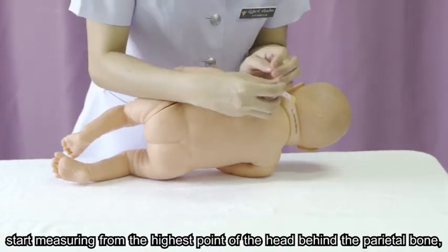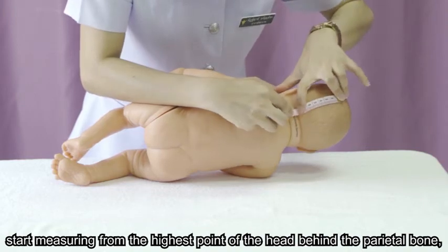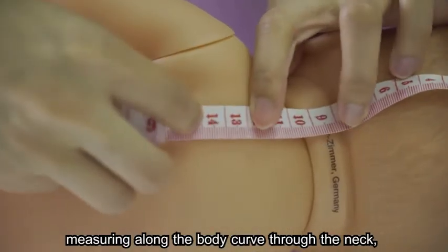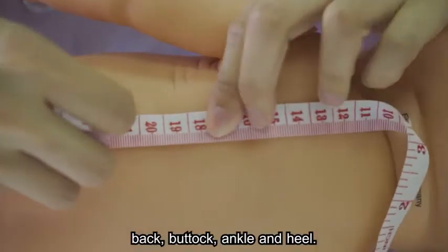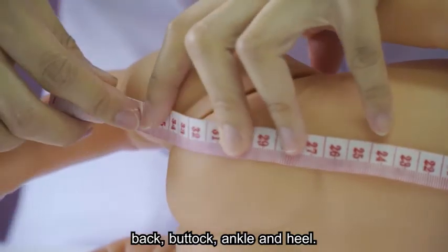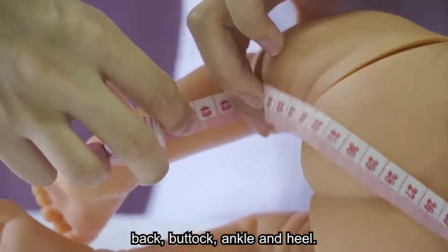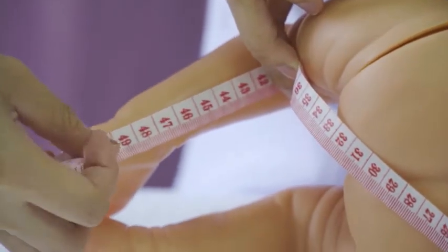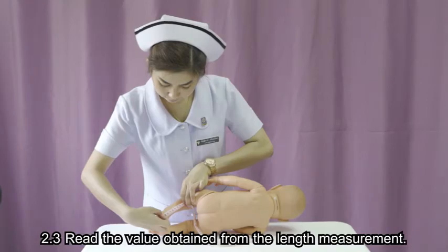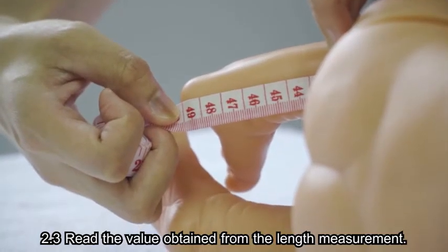Start measuring from the highest point of the head behind the parietal bone, measuring along the body curve through the neck, back, buttock, ankle, and heel. And 2.3. Read the values obtained from the length measurement.